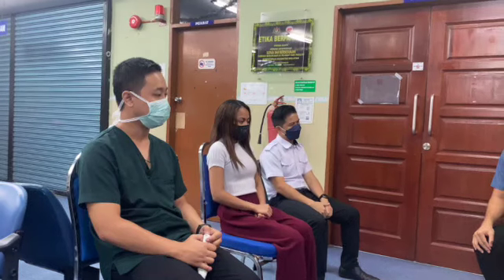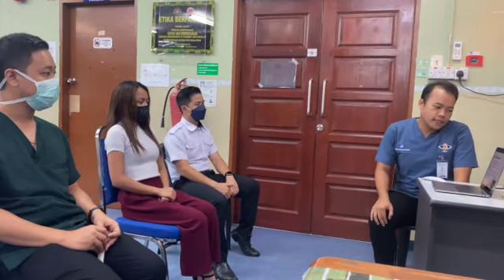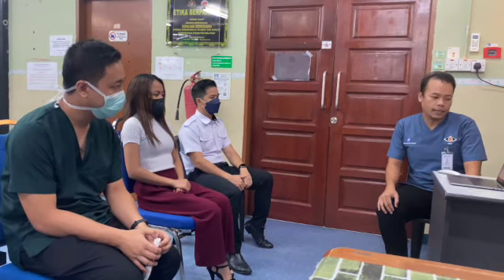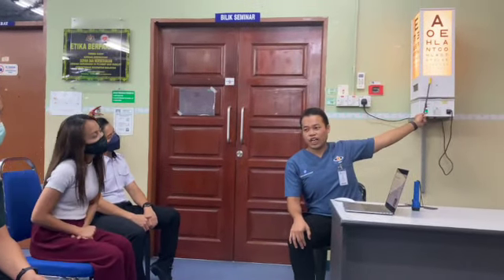Alright. Next, we are going to do some practical regarding these tests. First, what we need to do is prepare our equipment. The most important thing we must have is this one. This is what we call a Snellen chart.